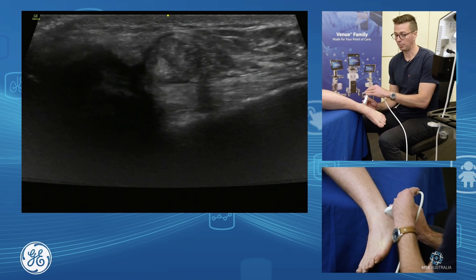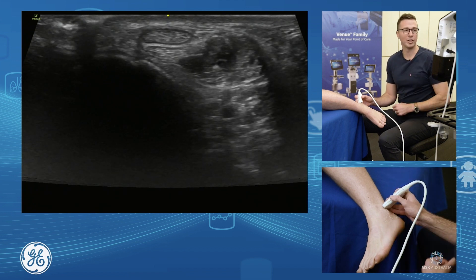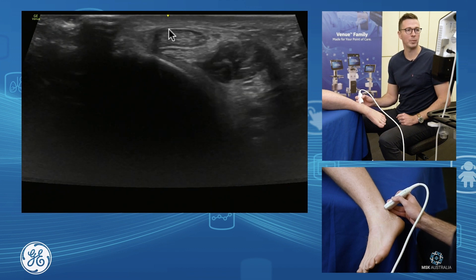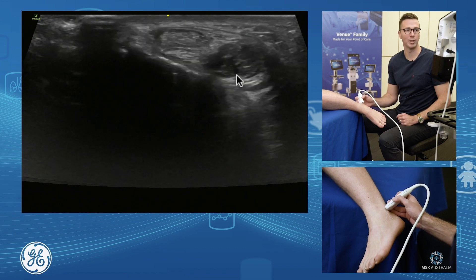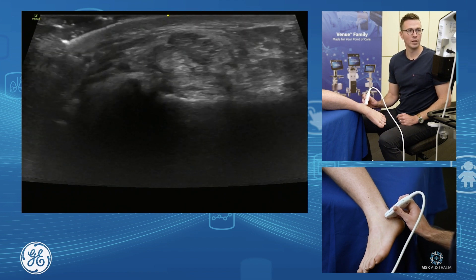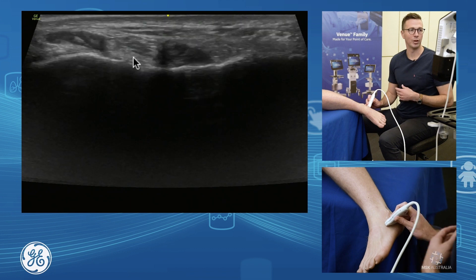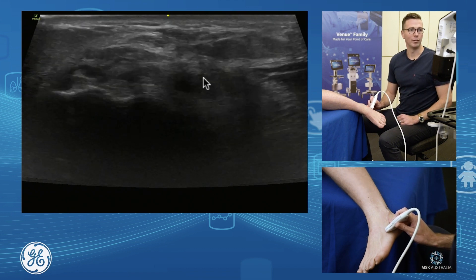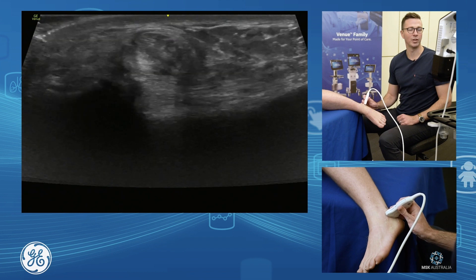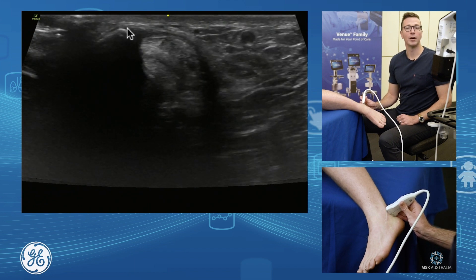From here we're going to talk about our peroneal tendons. We're just going to follow our peroneals up and around. Peroneal tendinopathy is quite a common pathology, especially in people with high-arched feet. We have peroneus longus sitting on top and peroneus brevis sitting underneath, with its low-lying muscle belly, closest to the fibula. As they wrap around the fibula, over the subtalar joint, down towards the peroneal tubercle, they go their separate ways - longus wrapping underneath the foot and brevis going down towards the base of the fifth metatarsal. Peroneal tendinopathy assessment usually happens around the malleolus or around the peroneal tubercle.